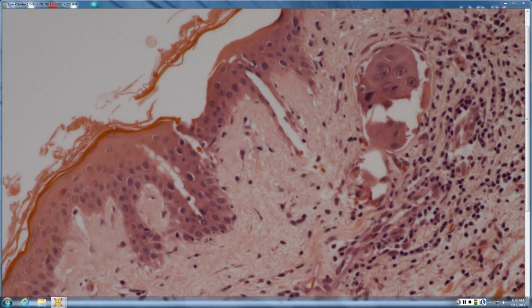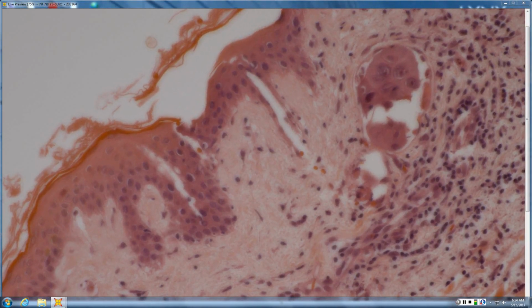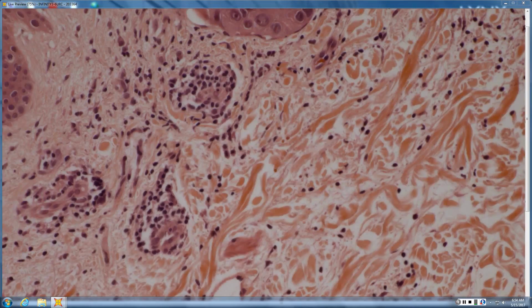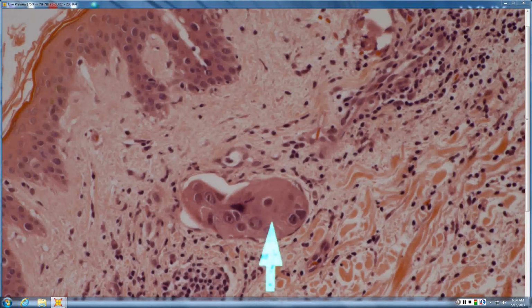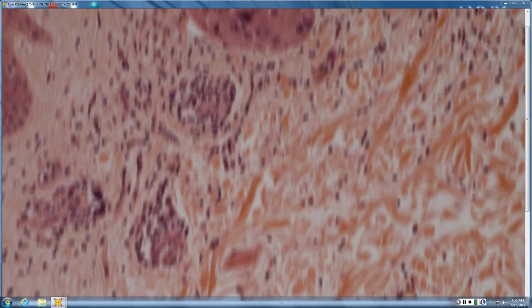And the history here would hopefully be helpful as well, which for this one was rule out cellulitis of the chest wall. So basically, exactly what the patient that you had seen, and you can see, this is within true lymphatic space. You can see the little endothelial cells here around. Let me get that in view here. You can see the actual endothelial cells around, and just this little island of lymphatic extension of breast cancer within.